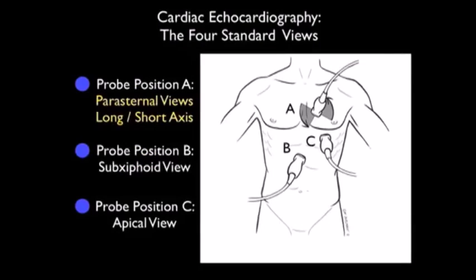So in conclusion, the parasternal short axis view of the heart gives a great deal of information about the contractility of the left ventricle. This will allow you to identify patients who may have a cardiogenic cause for their presentation. Echo is an excellent way of imaging the patient's heart and getting a lot of information directly at the bedside.